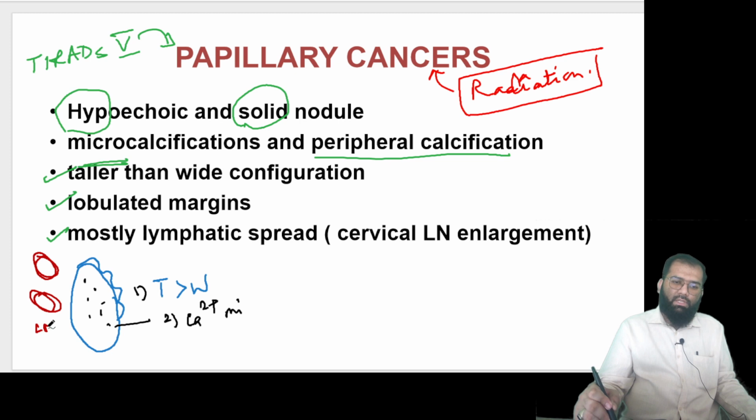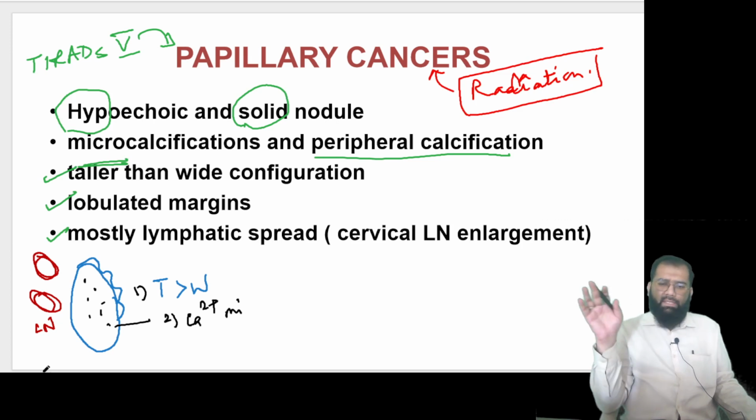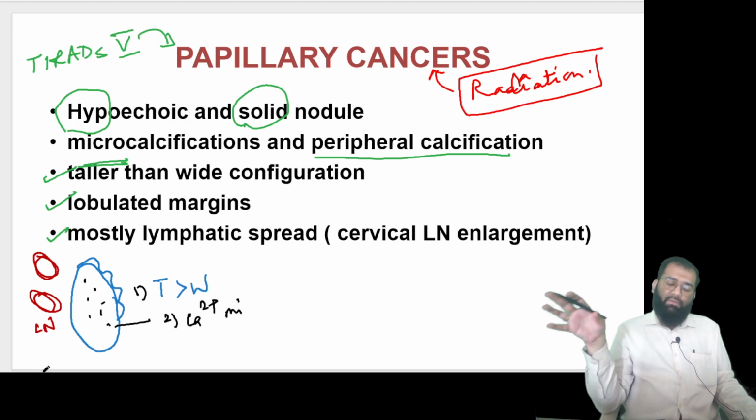So lymph nodal spread. And there is a very special feature. Now lymph nodes can be seen in multiple diseases. बहुत सारे differentials होते हैं जहाँ lymph node दिखते हैं, reactive हो सकते हैं, ट्यूबरकुलोसिस हो सकता है, मेटास्टेसिस हो सकता है, पेपिलरी सीए का मेट्स हो सकता है, बट हाउ टू डिफरेंशिएट, आप इन सबको डिफरेंशिएट कैसे करोगे, व्हाट इज द वे टू डिफरेंशिएट देम.